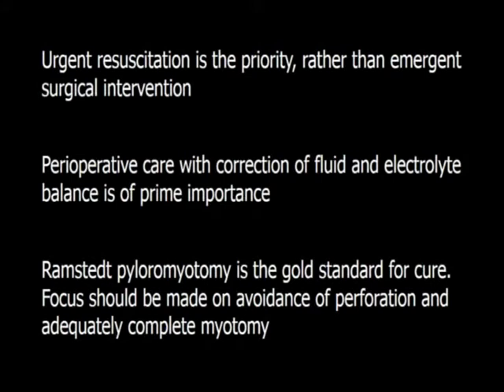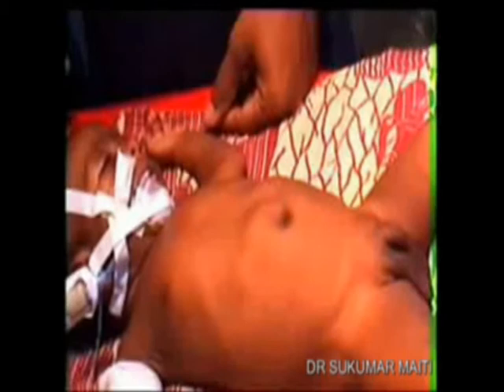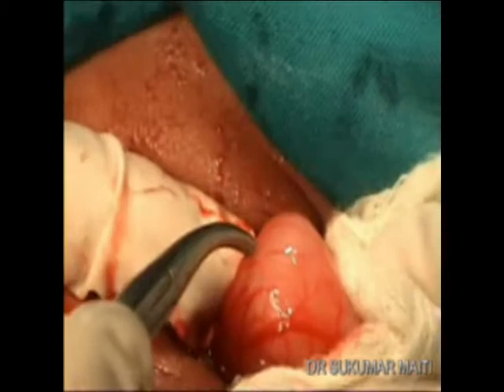Before operation, urgent resuscitation is mandatory. Fluid and electrolyte correction is of prime importance. Till now, open pyloromyotomy is the most commonly performed operation worldwide. The standard incision for open pyloromyotomy is the right upper quadrant transverse incision. However, it may also be done through a supraumbilical incision.